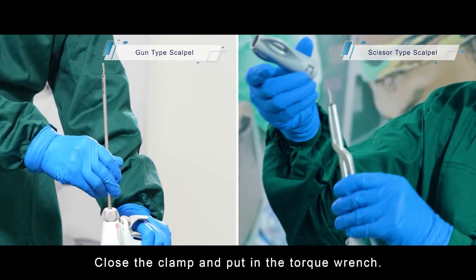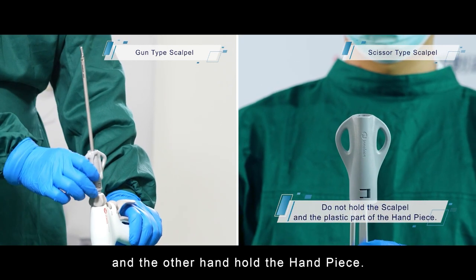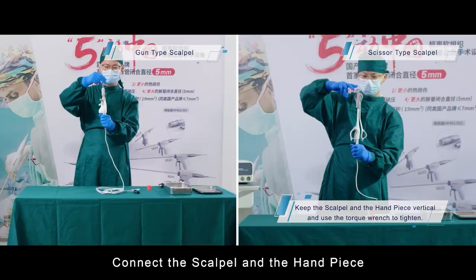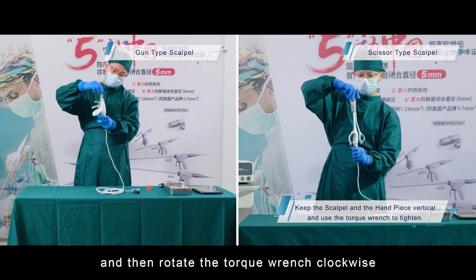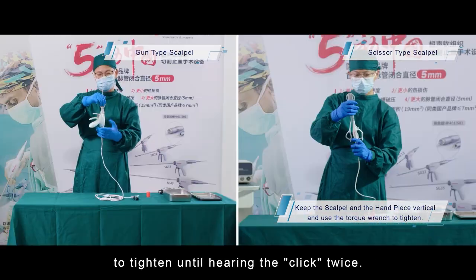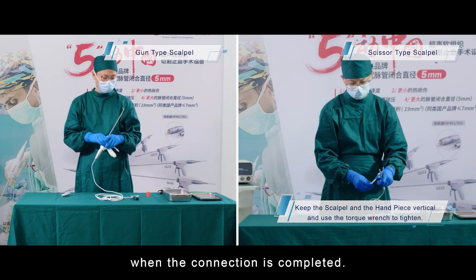Close the clamp and put in the torque wrench. One hand holds the shaft and the other hand holds the handpiece. Keep them vertical. Connect the scalpel and the handpiece by rotating the shaft clockwise until it is tight, and then rotate the torque wrench clockwise to tighten until hearing the click twice. Remove the torque wrench when the connection is completed.